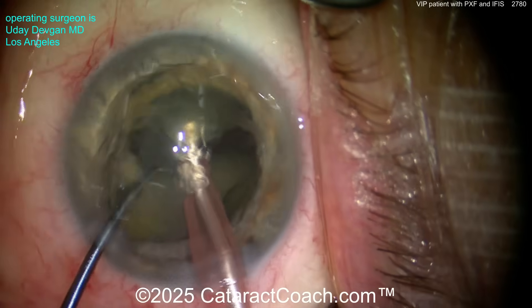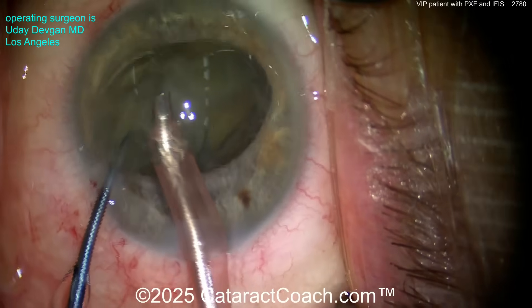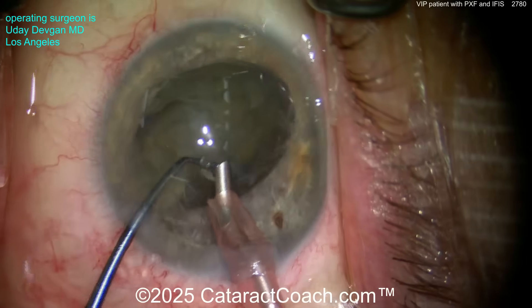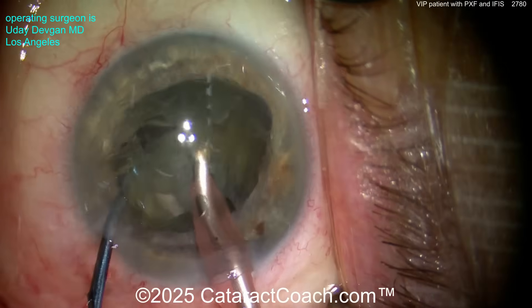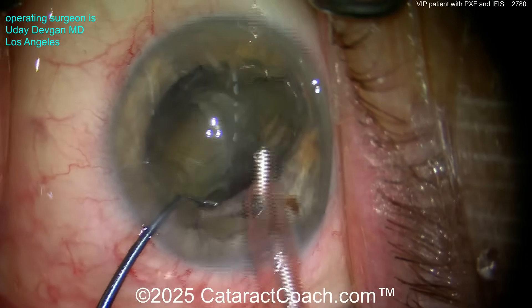Ready? One, two, three — pow. Split that nucleus beautifully. Now let's aspirate out that first piece — the first quadrant or half — and then chop some more. Chop, chop, and more chop is the name of the game for me. Here's another chop, there it is. We'll chop this up pretty nicely.